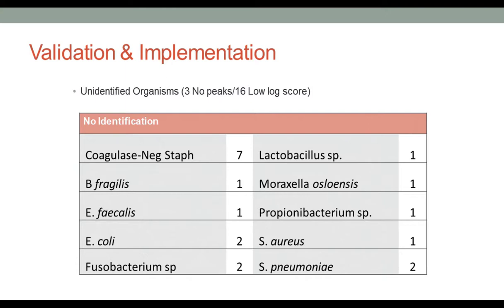That's per batch. And one other thing, too, with our method that we're currently using, this was the initial protocol that we developed. But now there's a more rapid, streamlined protocol that we've actually validated, but we just haven't put into place yet. And it will probably reduce that processing time by about 5 minutes or so.